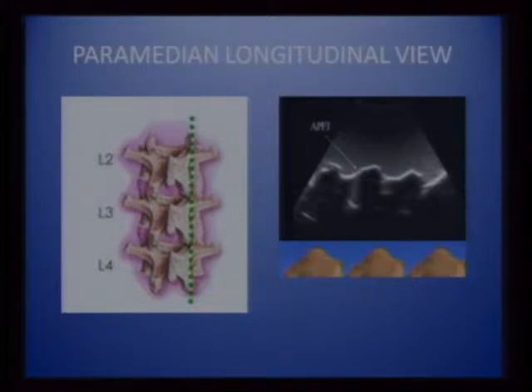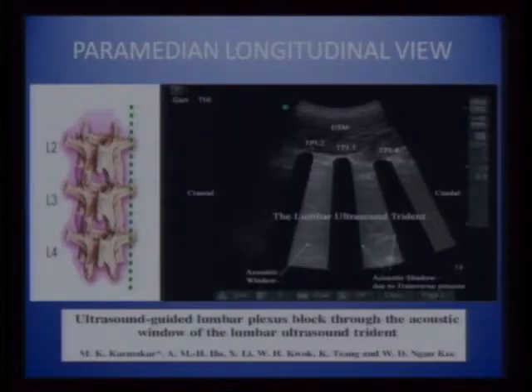So ultrasound for the spine actually refers to a lot of animals and animal parts. When you pick up patterns, you say camel humps, you say heads of galloping horses, frog's eyes. You also have cat's whiskers and bat's wings and so on.